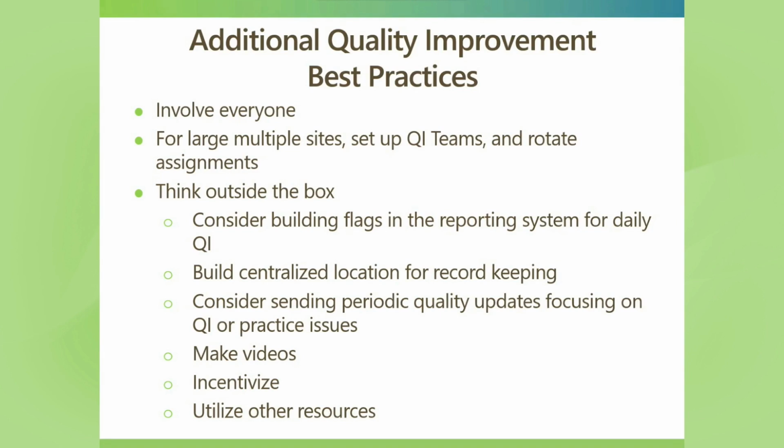And speaking of videos, make videos. If you have found a setting on a machine at your site that's really helpful, maybe for bringing in coronary color flow, if you're looking at coronary arteries in pediatrics, or you found that there's a nice penetration setting for some of your big patients, or you found a really cool way to utilize contrast that you make it better, you've optimized it, make a video, post it to your SharePoint site. Consider sending a periodic quality update focusing on any practice issues.